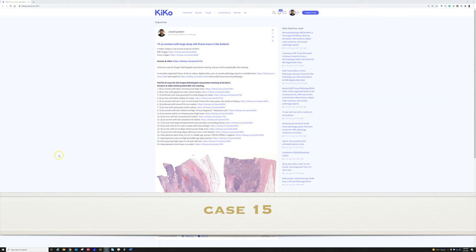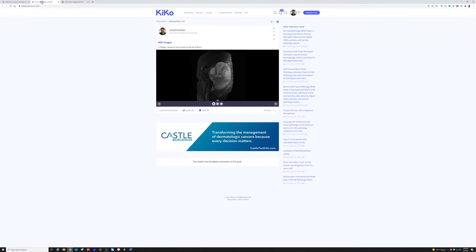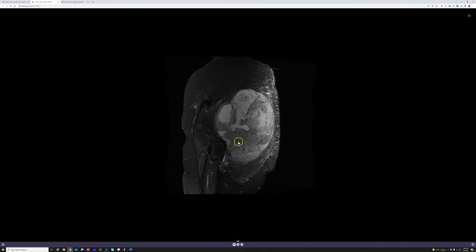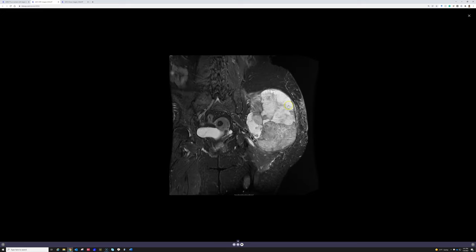A 70-year-old woman with a large deep soft tissue mass in the buttock. We've got MRI and gross photos for this. Here are the MRI images — you can see a very large mass in the musculature that is very heterogeneous, with multiple lobules and different signal intensities. The heterogeneity in a large deep soft tissue mass is very concerning for a high-grade sarcoma.